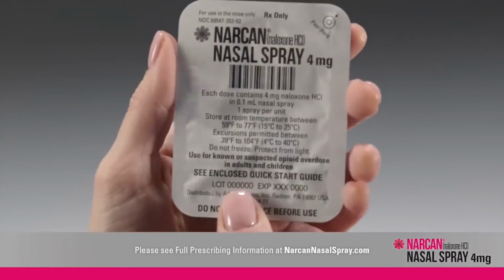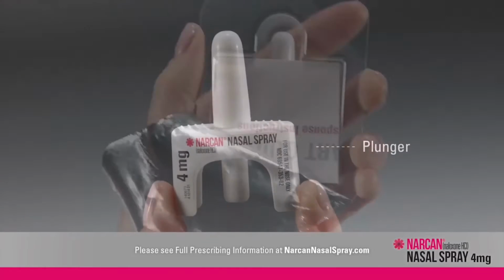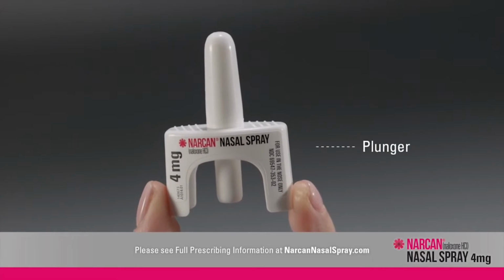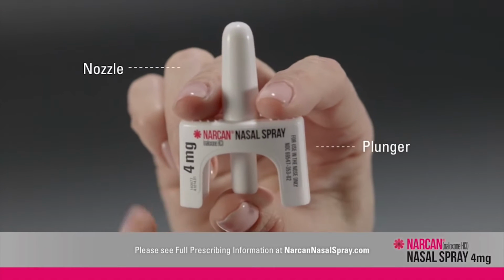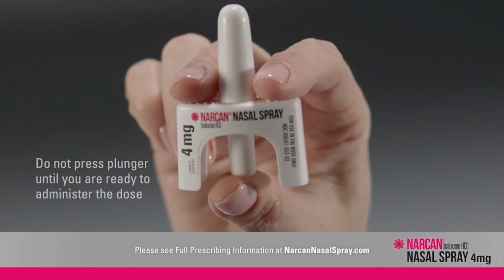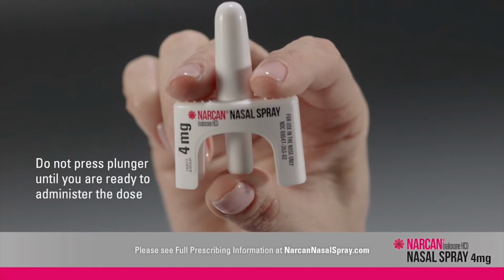Remove Narcan nasal spray from the box. Peel back the tab with the circle to open it. Hold the Narcan nasal spray with your thumb on the bottom of the plunger and your first and middle fingers on either side of the nozzle. Do not press the plunger to test or prime the device. If you do, you will waste all or part of the dose of medication.